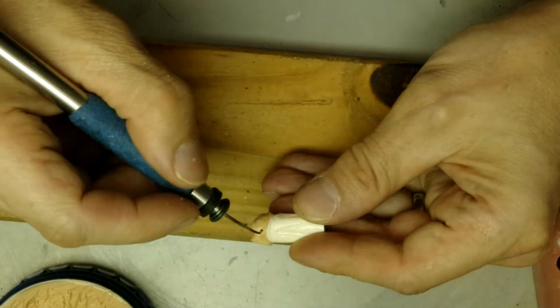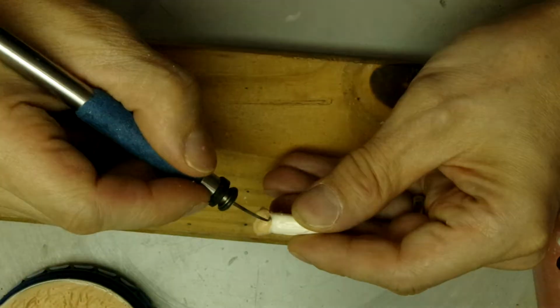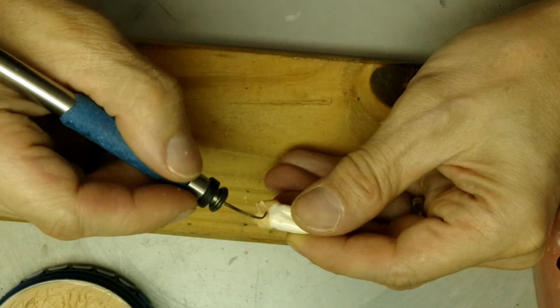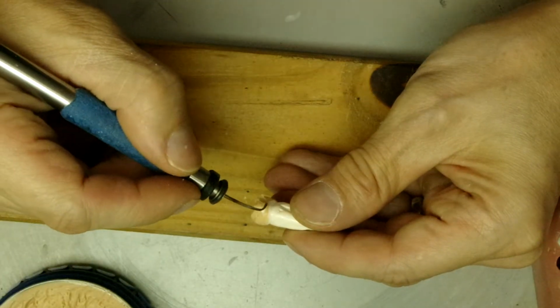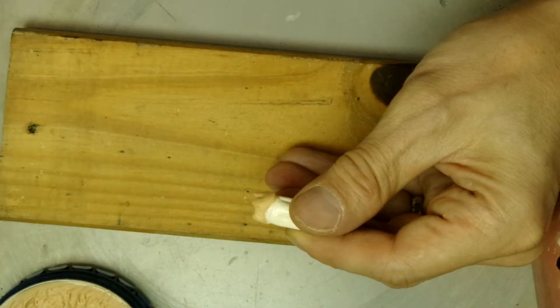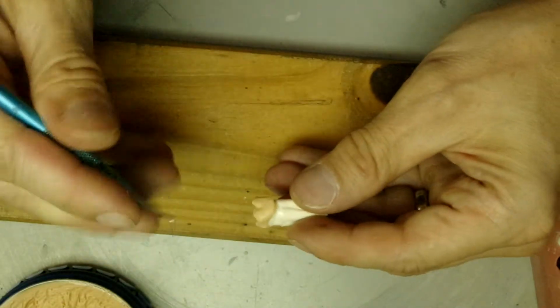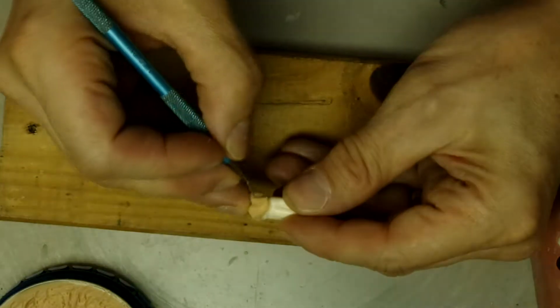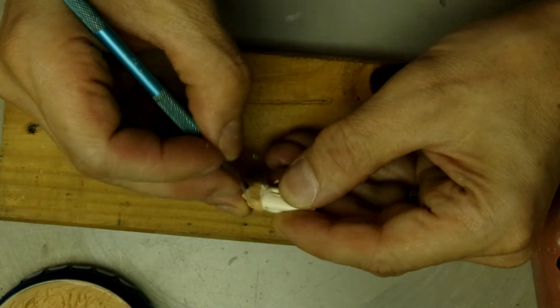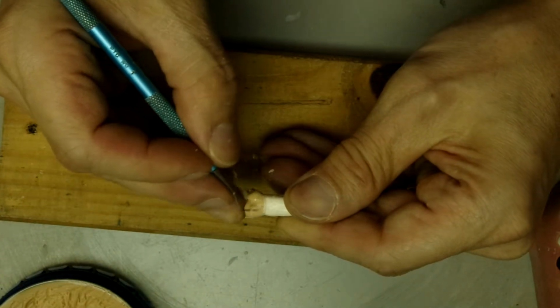A little smoky there. And just melt it right in there. After we fill that up, just go around the margins with the instrument. Make sure that the wax goes exactly to the margin.